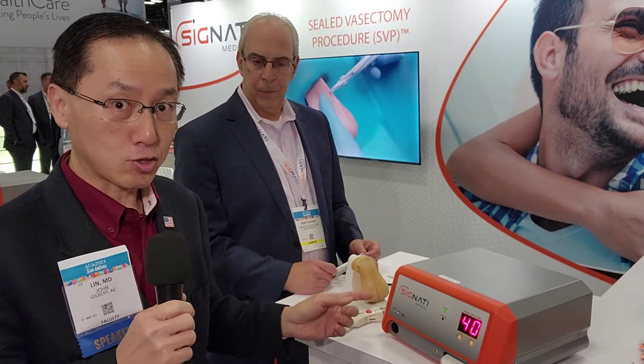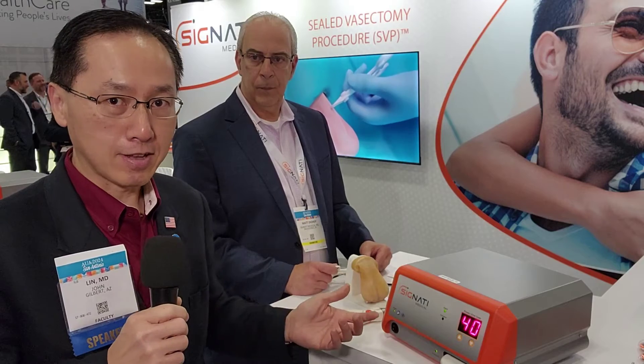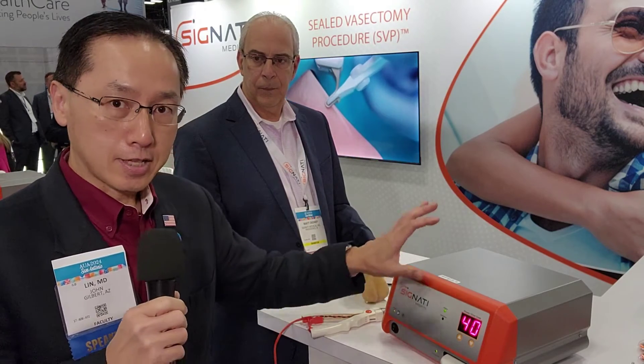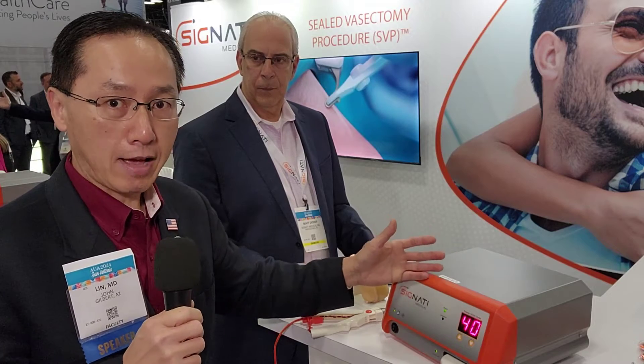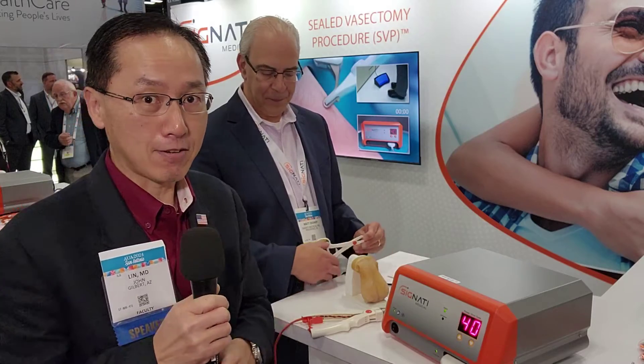Think of it as a ligature device, except it's transdermal if you want to do it that way, or you can expose the vas and then perform the procedure. It comes with a generator, and the disposable will be the kit, which will probably come in boxes of five — to be announced. Let me show you how this is actually done. Pretty exciting stuff.